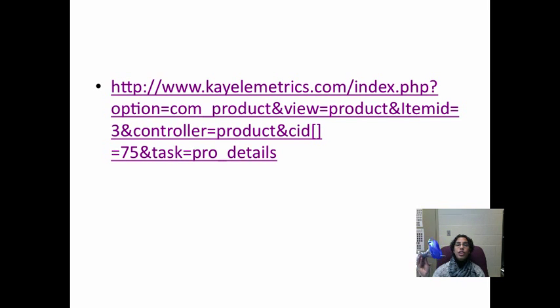It's called the Phonatory Aerodynamic System, PAS. Phonatory Aerodynamic System, the PAS. It's an instrument that helps us obtain measures of airflow and pressure. It gives us an indirect measure of subglottic pressure. So if I asked you, give me an instrument that helps us measure airflow and subglottic pressure, you can talk about the instrument, which is the phonatory aerodynamic system. You can give an example as a Rothenberg's mask. You can give me manometer for pressure, right?